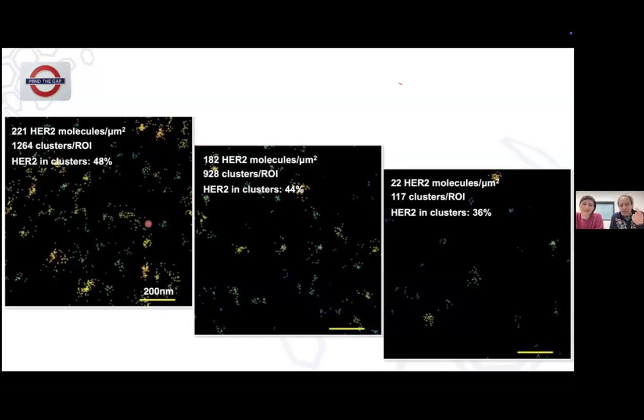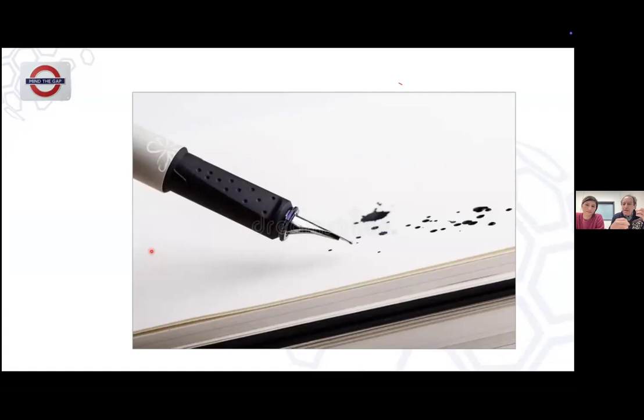What happens if you stain by chromogen one of these molecules? You see nothing, because you deposit chromogen on there and there is too little for you to see. I think you start to see staining the moment there are clusters, and the moment this cluster deposits enough chromogen to be visible with your microscope. So a bit like an ink spot, you know?